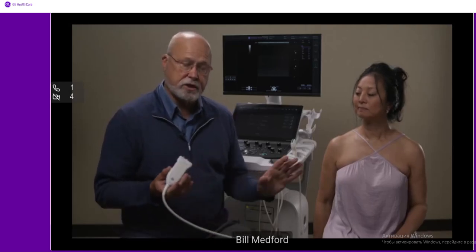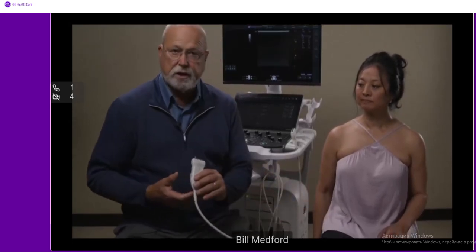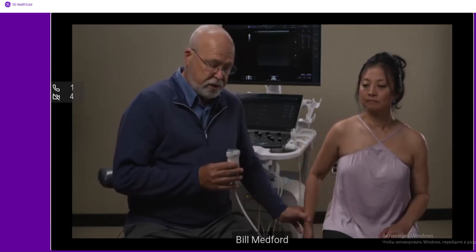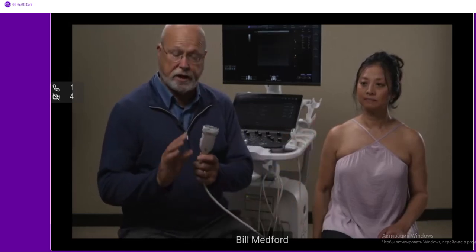I'm going to begin with something that I actually look at as part of my routine exam that Dr. Meenakshi covered in great detail, the rotator interval and the supporting ligaments that might be thickened in cases of adhesive capsulitis. So I look at the rotator interval and I start with the patient's arm down by their side. Now, if it's somebody with excessive lateral body wall mass and their arms out here, you might not be able to do that. You might have to bring their hand up further to their hip. But most patients that I examine, I can scan with their arm comfortably down by their side.